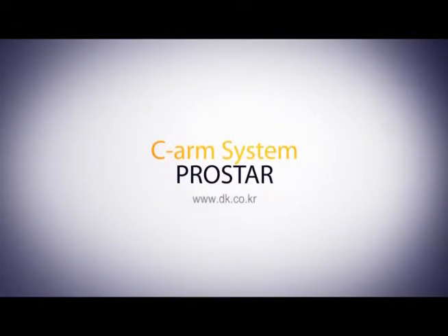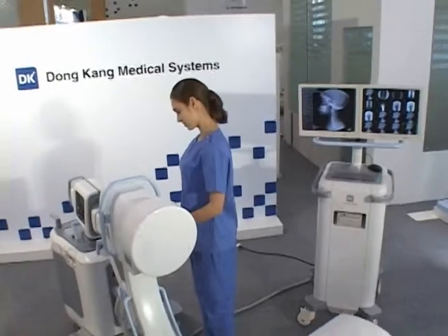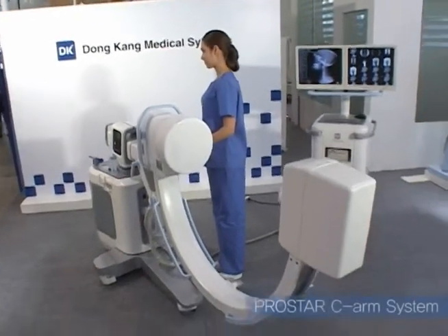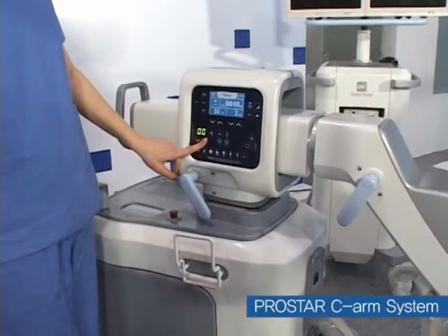C-Arm System is a portable equipment designed to be used in narrow spaces such as surgery rooms. It applies ergonomic data and enables effective use.